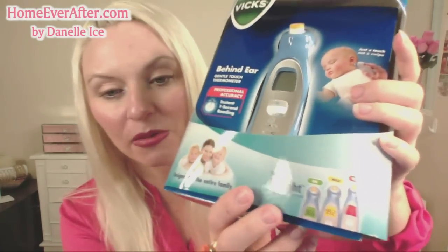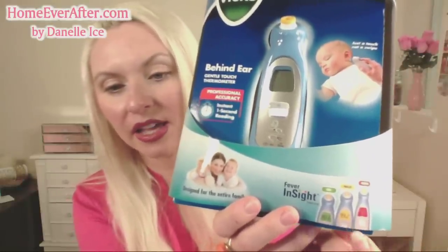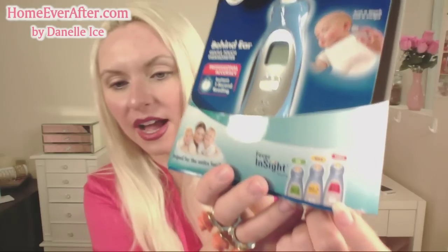Once I was able to get it out, here's what we've got. This part of the packaging gives us some information: designed for the entire family, behind the ear gentle touch thermometer with professional accuracy, one second instant reading, just a touch not a swipe, and it works behind the ear. It comes with fever insight, which is the part I really like — it lights up green for okay, yellow for mild fever, and red for high fever. That's really handy, especially for anyone trying to take a temperature of a sick baby in a dark nursery.